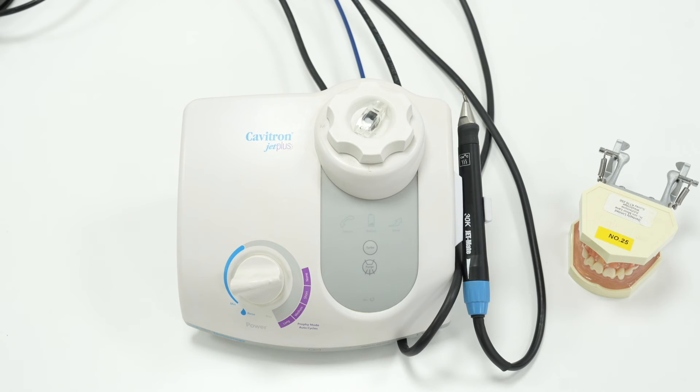So the most popular option is to select none, which means that when the foot pedal is depressed, the polishing powder comes through. When not depressed, it stops, which is the easiest and most predictable way to use the profi mode.